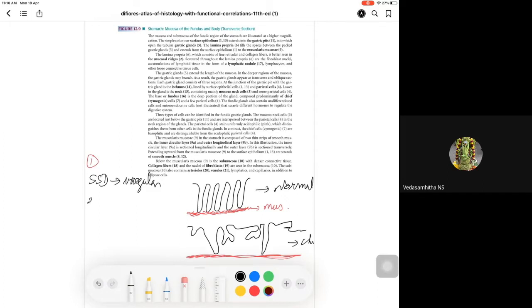Number two, basal plasmacytosis, basal plasma cells. Remember, I told you, normally you see the plasma cells in the upper part, whereas here you can start seeing them in the basal portion. Sometimes they will be crowded in between the base of the gland and the muscle. They will be sitting between the gland and the muscle, which is totally abnormal. They should not come in between the glands and the muscle. Basal plasma cells, and this is also known as bottom heavy.